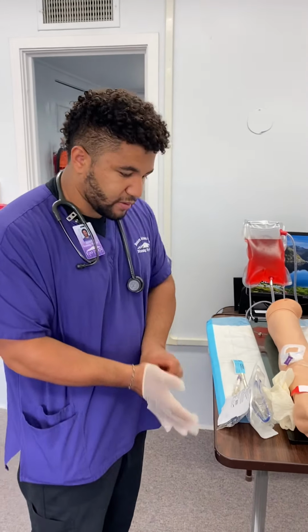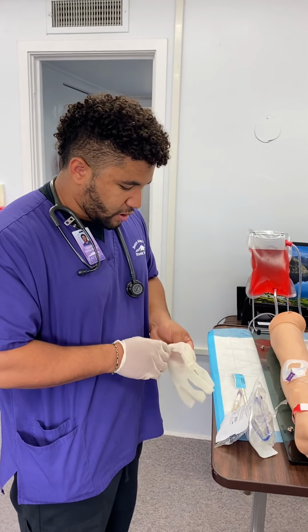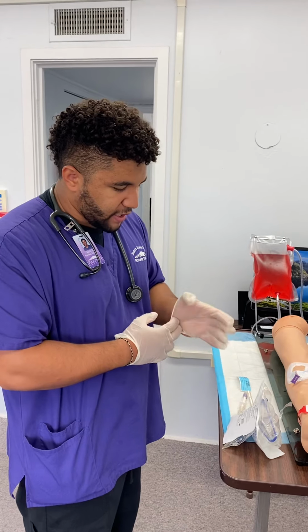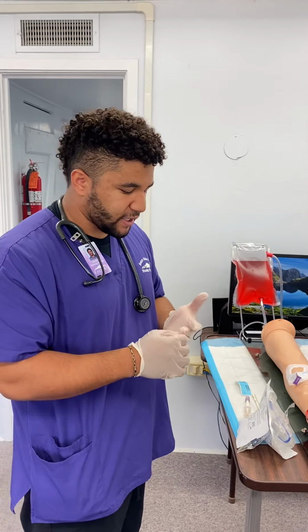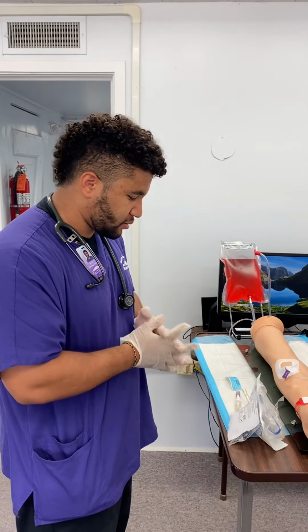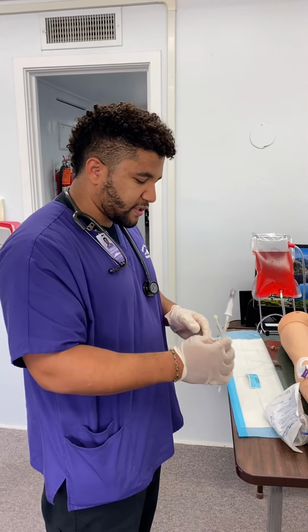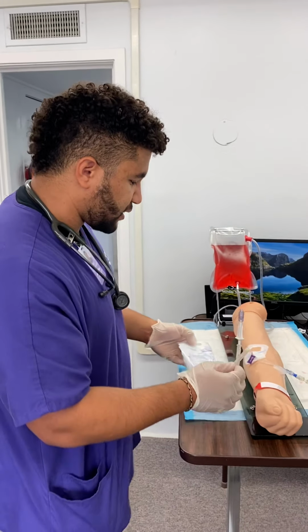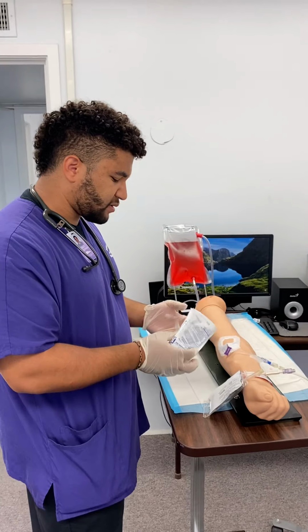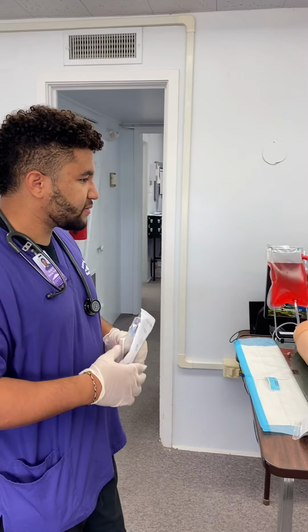And we can go ahead and slip on our gloves. While you're getting your line ready, this would be a good time to explain to the patient about the side effects related to the drug. So, Mr. Waters, the doctor, like I said, has ordered an antibiotic for you. This antibiotic does have some side effects, some GI problems, some nausea, vomiting, diarrhea.